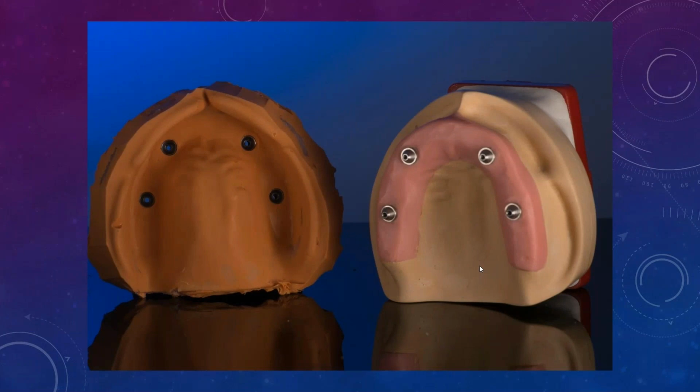But if you guys want to go a different route, let's say, for example, you don't want to do those metal verification jigs because they're pretty expensive, guys. The kit is like $1,000 and refills for each, because it's like a case with a bunch of little bars with different lengths, and each refill is like $45, which isn't bad, but buying the $1,000 thing initially is kind of pricey. There's other ways of doing it.